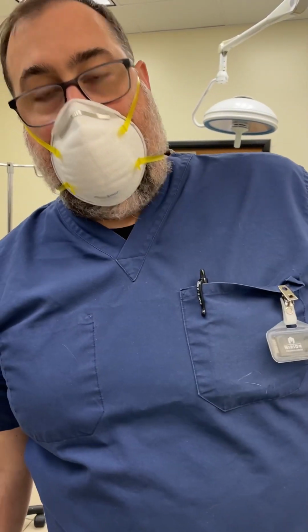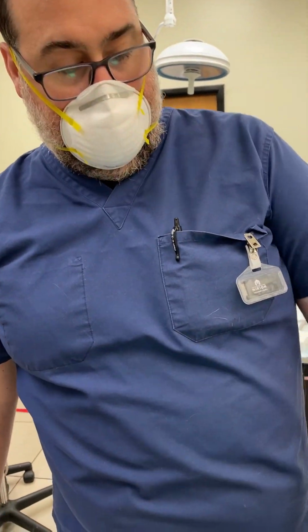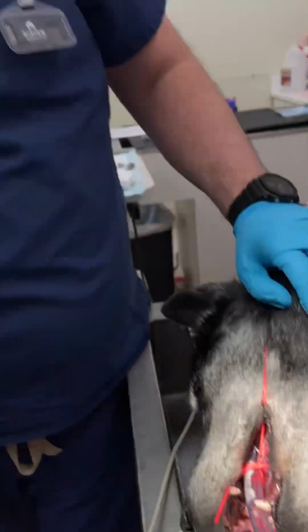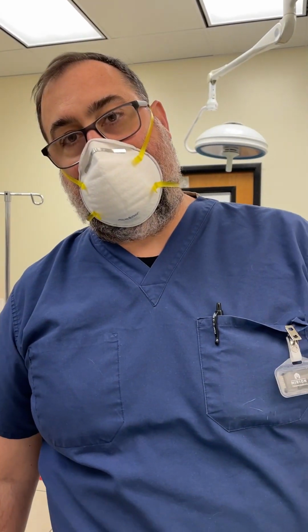I'm Dr. Ashbran. We're going ahead and doing a dental today on this 12-year-old Labrador mix. She came in last week for a suspected tooth root abscess. So we got her under anesthesia today, cleaned her teeth and probed them, took x-rays, which shows us what's going on underneath the gums, lets us know what we can't see.